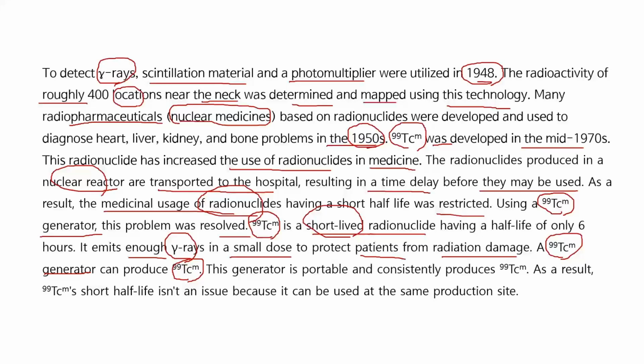This generator is portable and consistently produces TC99M. As a result, TC99M's short half-life isn't an issue because it can be used at the same production site.